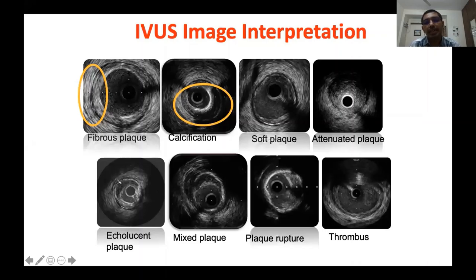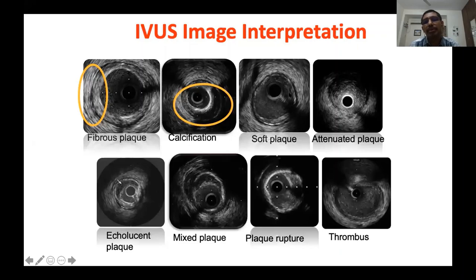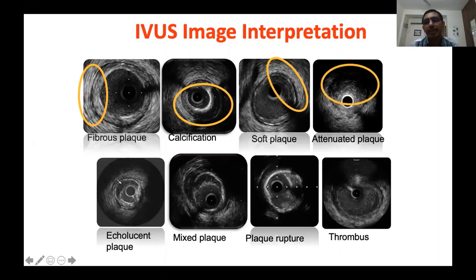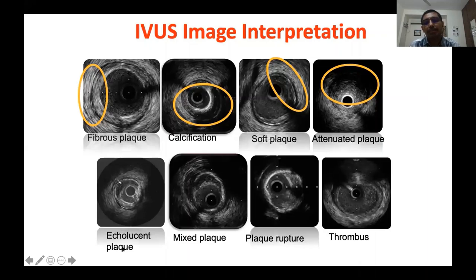In contrast, here you see a plaque that is hypoechoic compared to adventitia — that is called a soft plaque, most probably containing more lipid material. Two special types of soft plaque: first, attenuated plaque — an isoechoic plaque with deep signal attenuation. The second special type is echolucent plaque — a plaque with intra-plaque echolucency. These two types of plaque are very important determinants of slow flow or no reflow and periprocedural myocardial infarction during PCI.